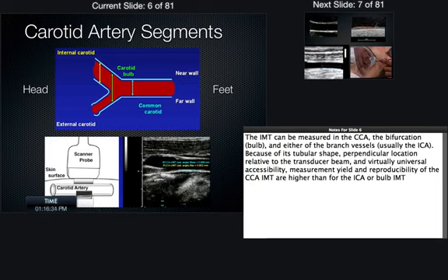It's a nice perpendicular reflection, which offers a very nice ultrasound image, and you can see along that far wall, kind of a schematic showing it here, it's a very thin little distance there. And in the models today, it's very difficult to appreciate because everybody's young. But if you come across somebody who's greater than 50 years of age, you'll start to see this area likely become a lot more prominent and easier to measure.